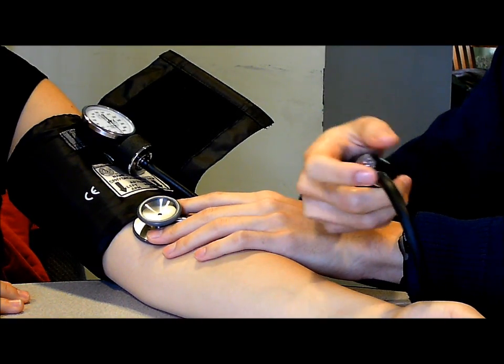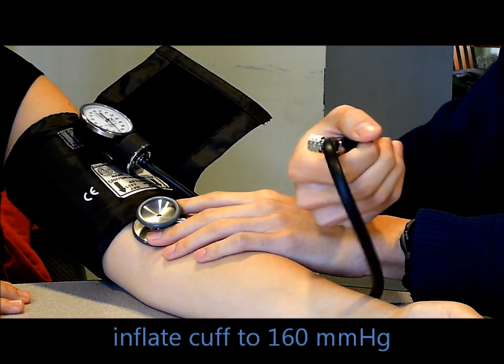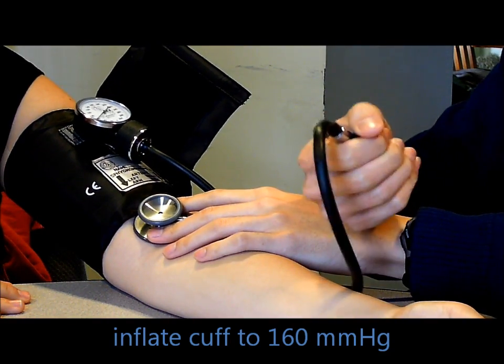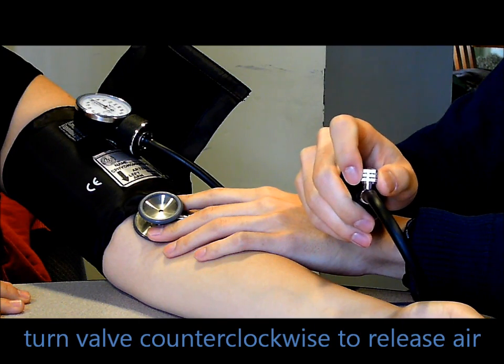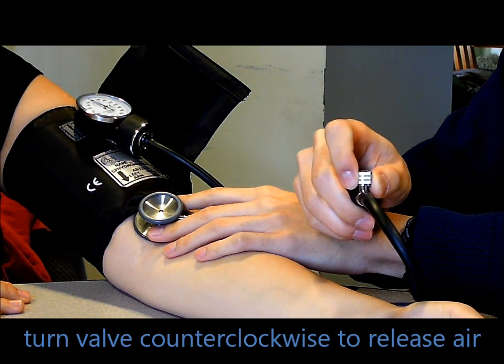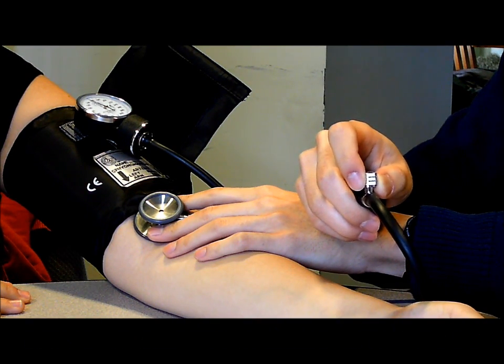Begin by inflating the cuff to about 160 millimeters of mercury by squeezing the pump to 160. As soon as you reach 160, grasp the valve with your thumb and index finger and slightly twist it counterclockwise to begin allowing air to escape at a controlled rate.